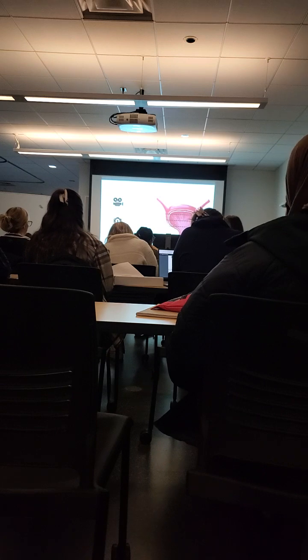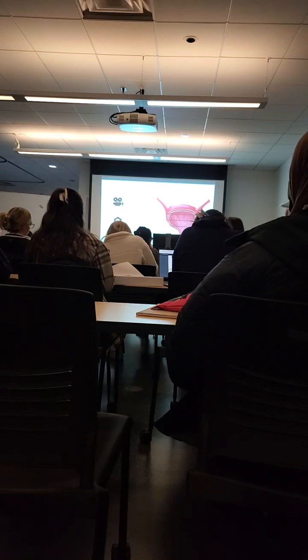If they don't have a full bladder, then I start with the kidneys instead of the bladder, because it takes 40 minutes, and it'll take you guys probably 20 minutes to get both kidneys. And then by that time, the bladder will fill. And if not, you're just gonna write, patient did not follow instructions, bladder was not full. Not much you can do. And then send them back to the front and we'll reschedule.